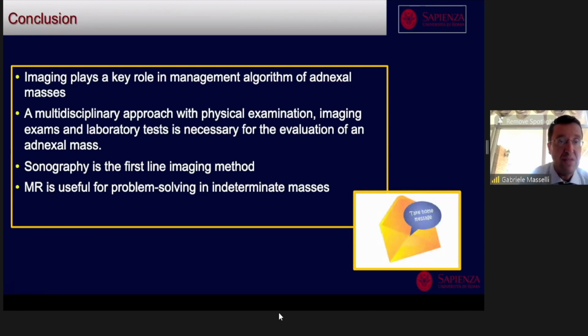So to sum up, imaging plays an important role in differentiating benign from malignant lesions, which can then help the management of these patients. Ultrasound is the first line imaging method. In case of inconclusive ultrasound, MRI should be performed. It is recommended to use the morphology, diffusion, and dynamic imaging characteristics provided by MRI to differentiate malignant from benign lesions.